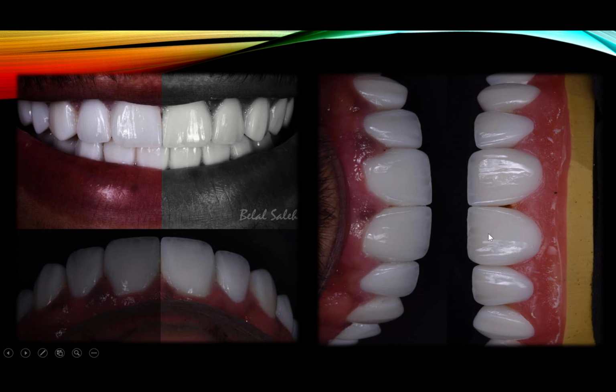All right. So you can go thin, leave all of the, you know, because in the veneers you have mesial and distal wings, as to speak. Mesial and distal wraparounds, mesial and distal wings. These wings, you really want it in a full pressed lithium disilicate. You don't want to layer there.